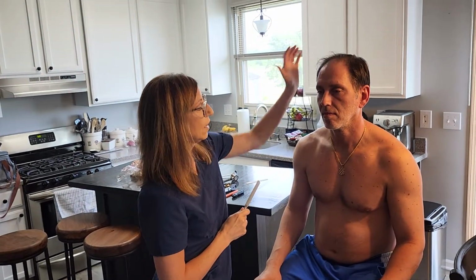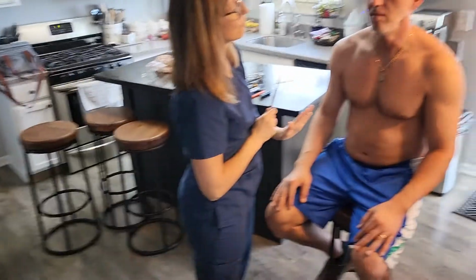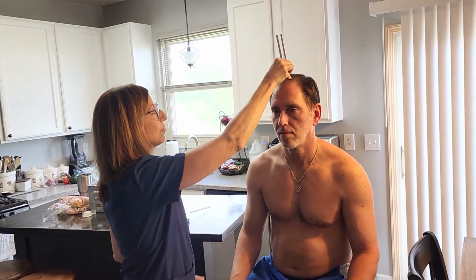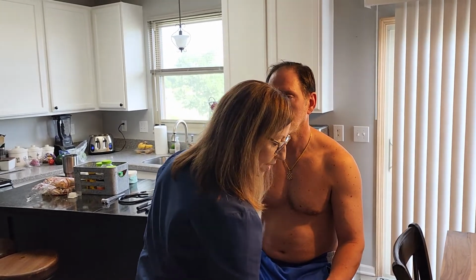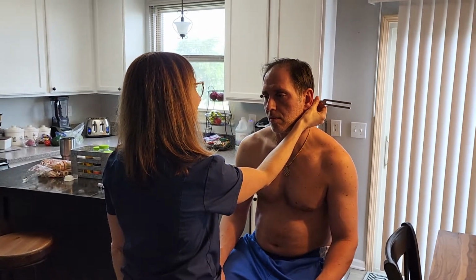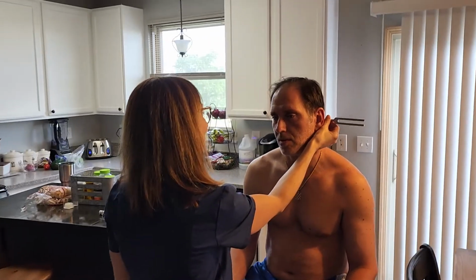I want you to tell me when I place this on top of your head, which ear you feel the vibration or hear a vibration more. If it's equal, just say it's equal, okay? Both. Okay, very good. That is the Weber, and this is Rinne. So now I'm going to place it on your mastoid bone. Tell me when the vibration stops. Right there. Okay.